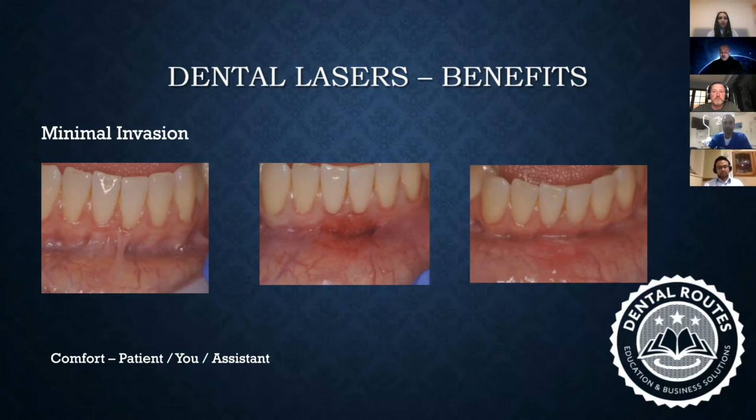You might have an overgrown gingiva where you just need to do a bit of a gingivoplasty. You need to do a bit of a crown lengthening. And these things were considered very hi-fi soft tissue surgical techniques in the past, and people used to get worried to be doing these things in addition to their day-to-day treatments. But now what has become so easy is a frenectomy like what you see on the screen takes me just 10 minutes. Okay, a frenectomy like that, just 10 minutes while I'm doing my implant treatment.